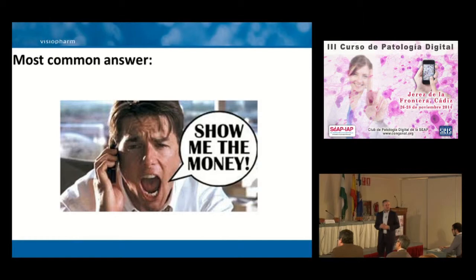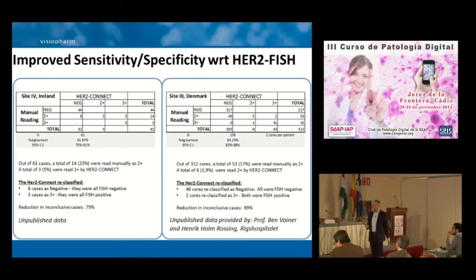So I'll try to show you money, at least for this one biomarker. We have a whole range of other diagnostic markers, but for HER2 just, let me just, this is a very busy slide, I apologize, but try to focus on this one. This is from Copenhagen, data from Copenhagen University Hospital. We are doing a national validation study, and this is by far the biggest hospital.